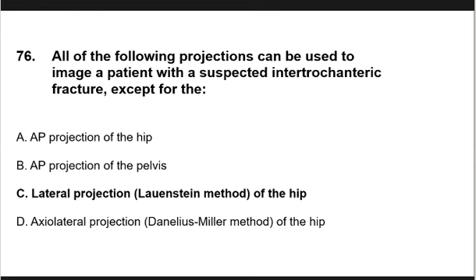Yung isa lang na hip joint ang naka-frog leg. So, sabi nga natin, kung mayroong suspected fracture of the hip joint, hindi po pwedeng galawin ang pasyente. So, ito lang ang sagot. So, ang Lowenstein method, that is a unilateral frog leg of the hip joint wherein the central ray is perpendicular or vertically directed. Ayan. Okay, so that is Charlie.